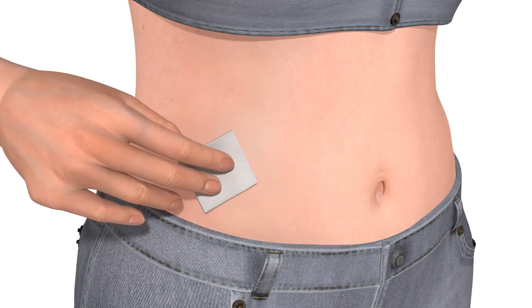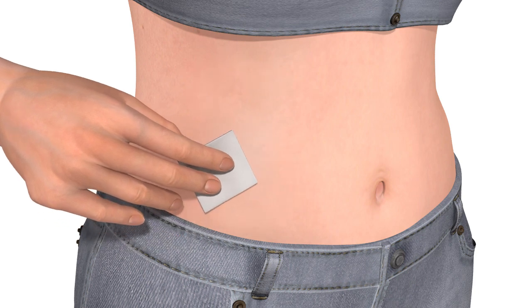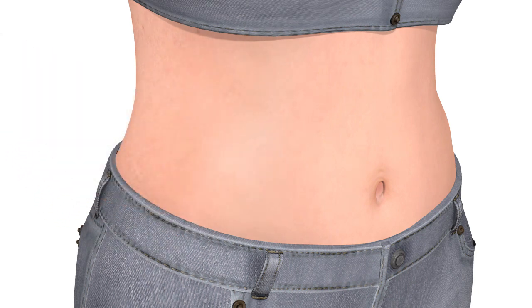Clean the insertion site with alcohol and let the skin dry before inserting the sensor. Do not use any other product or tape on the site before inserting the sensor.